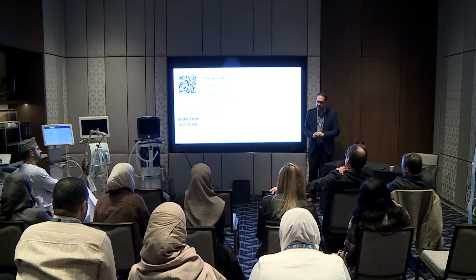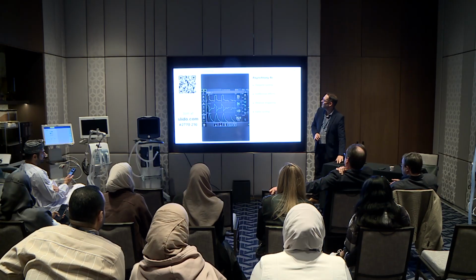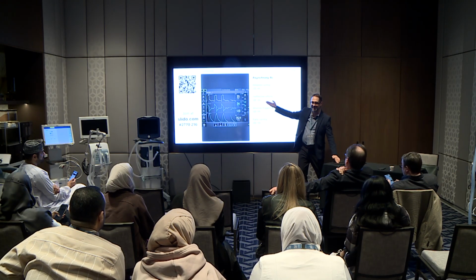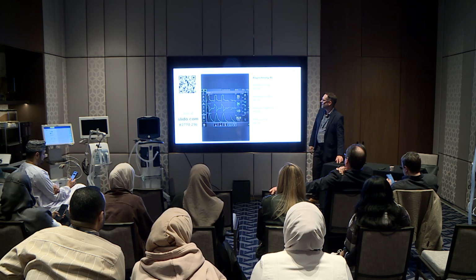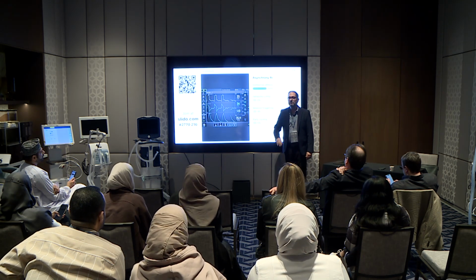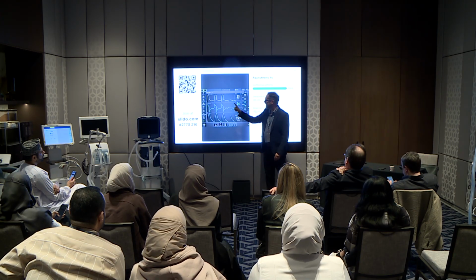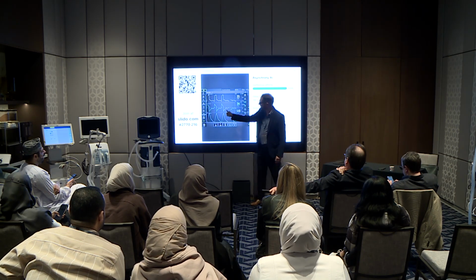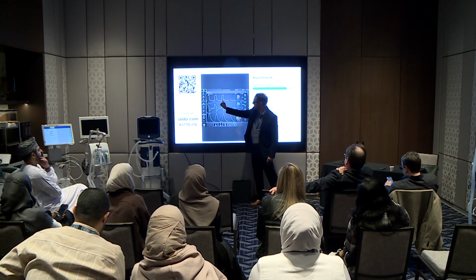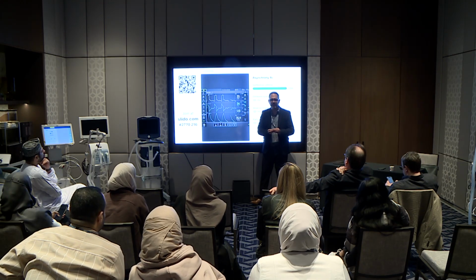Okay, last few here. I think we already answered this, so I won't even bother with the votes. It is ineffective efforts, is what we saw. It is not early cycling. Now, if someone said delayed cycling, that would be a correct answer, because delayed cycling can lead to ineffective efforts. In other words, they're starting the breath right here. They might be done inspiring here. It's hard to tell because I don't have esophageal pressure. But delayed cycling leads to it.